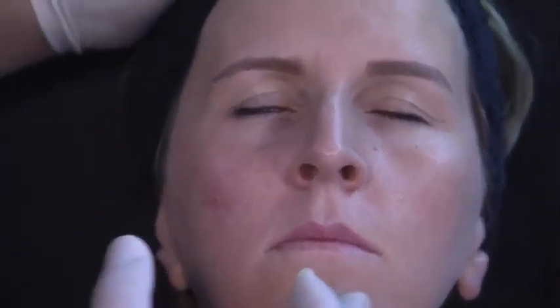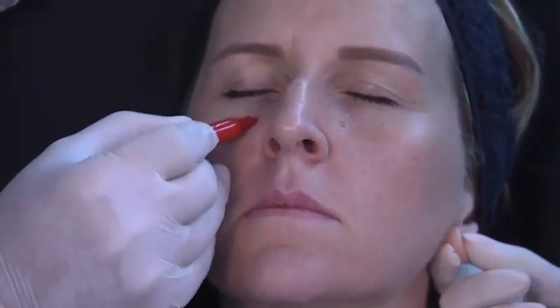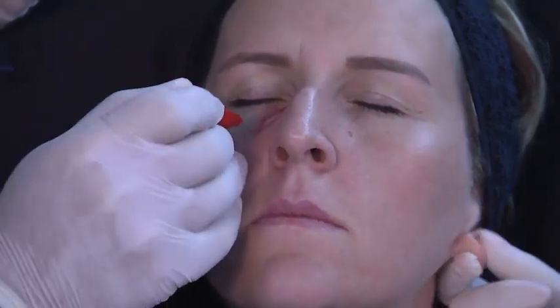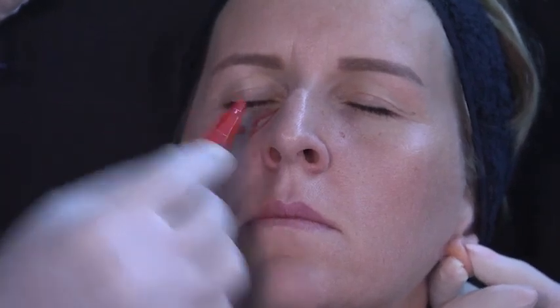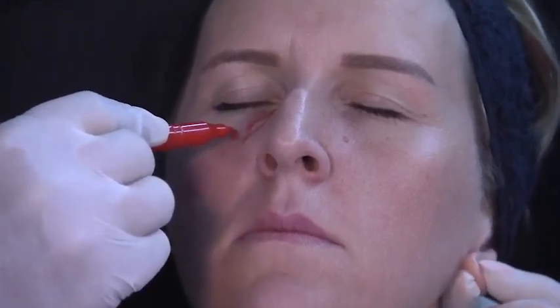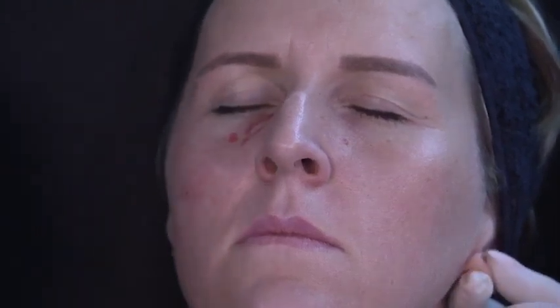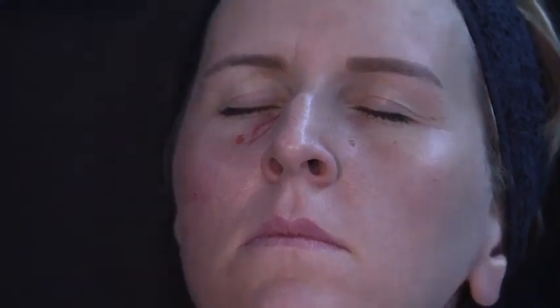I'm going to move the patient a little bit. So I'm going to start medial and lateral. I don't want my product and my needle to go in this dangerous area. So what I'm going to do is place my point in the medial part, in the midline, and because it's a moldable product, I will push with my finger towards the medial part, which is the dangerous area with the vein and artery. I'm going to go completely perpendicular.